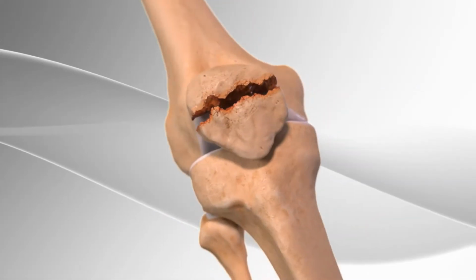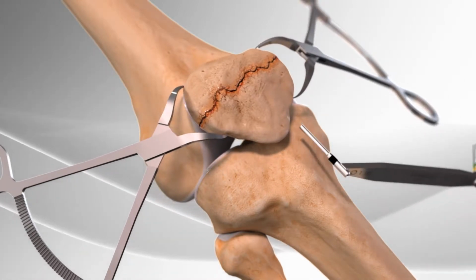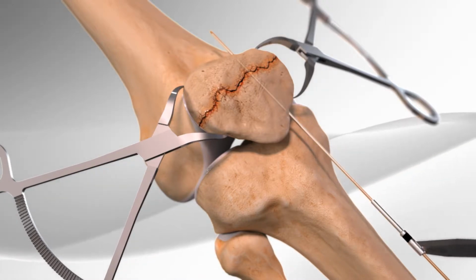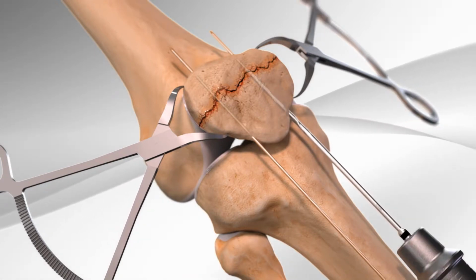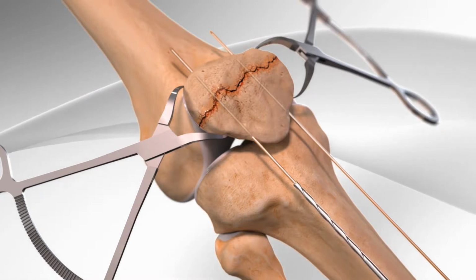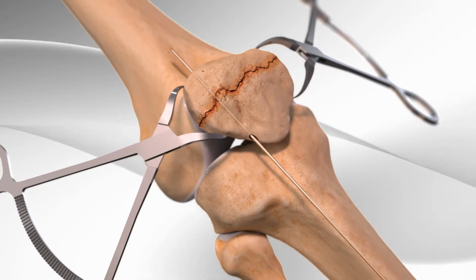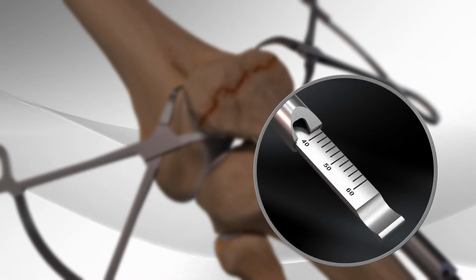First, the surgeon uses a clamp to close the space between the two broken halves of the patella. Then wires are placed to hold the broken bone together. The surgeon then drills through the bones where the wires are placed. And the drilled holes are measured to determine screw length.